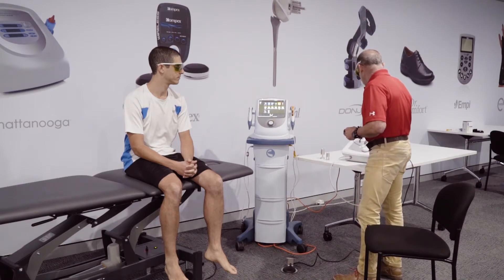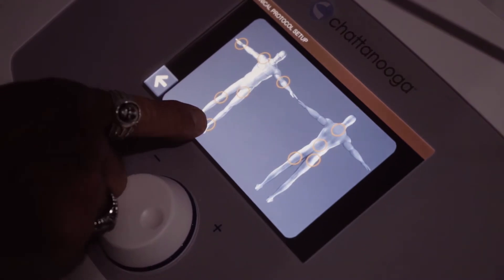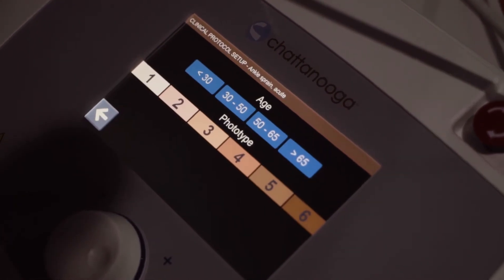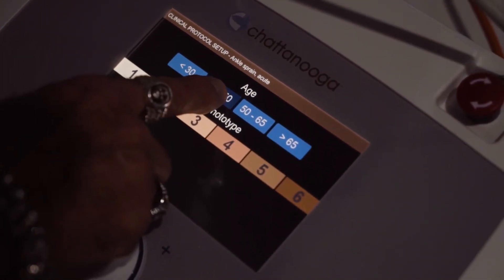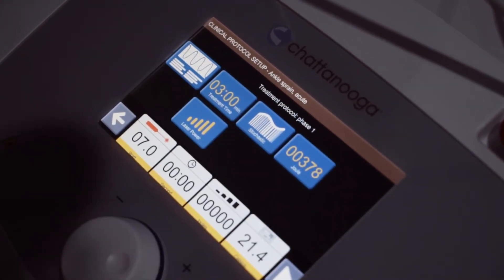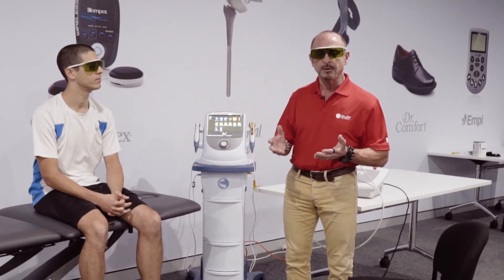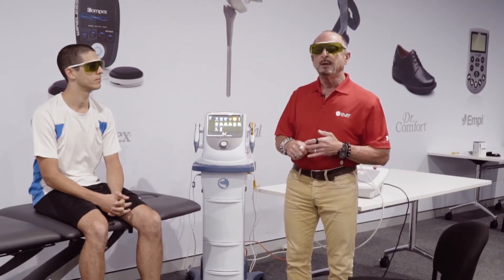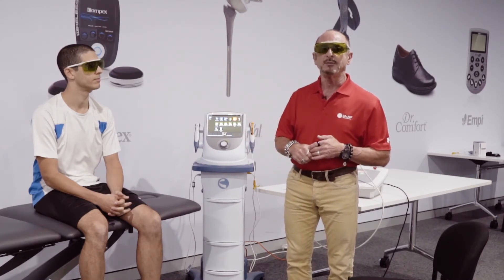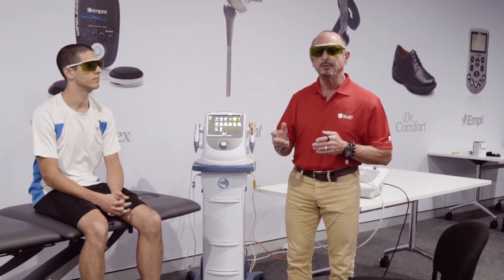Going through the prompts on this unit, what's of interest is that we need to make sure we have the accurate age and skin type. On these high-power lasers, age and hydration are big concerns. The younger the person, the better hydrated they'll be with increased muscle tone, so we need more energy. An older person may have less hydration and would require less. These factors help the machine select the appropriate protocol.